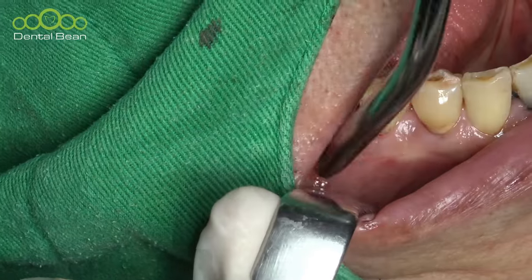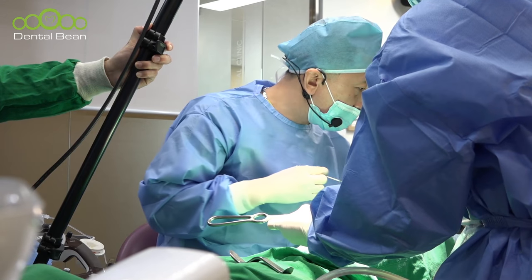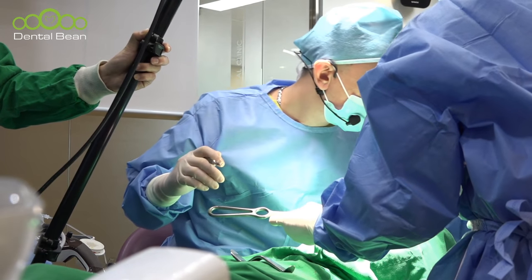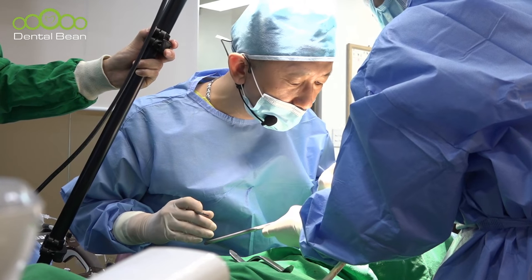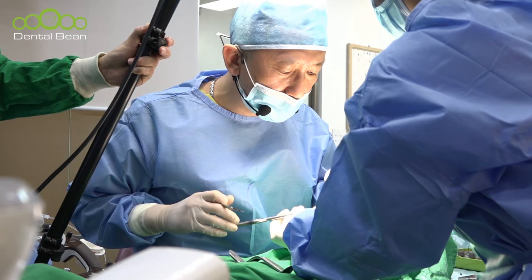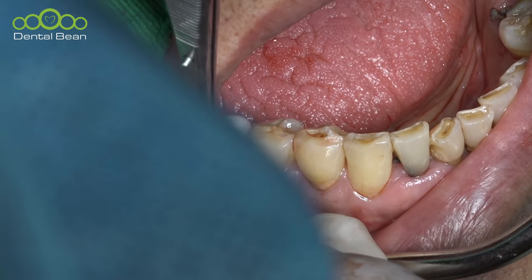I think the keratinization is good. So some excision is necessary. Just the V cutting. This area, V cutting is good. So slightly.